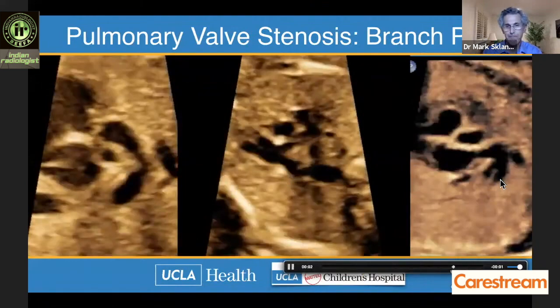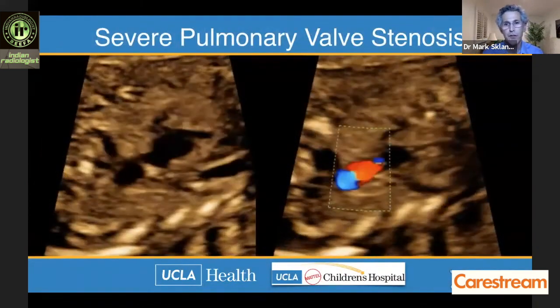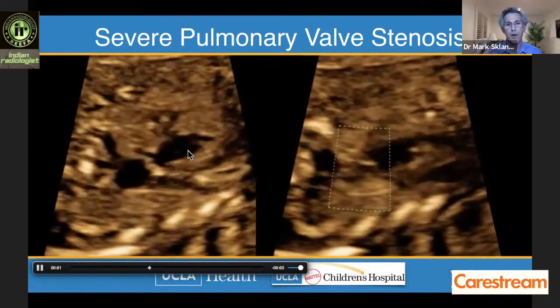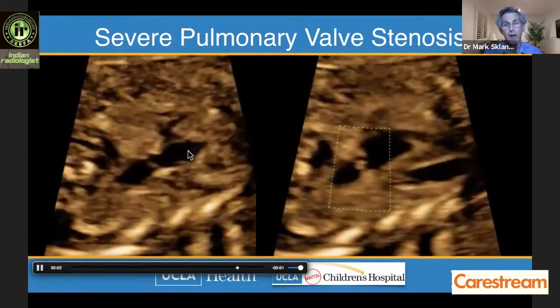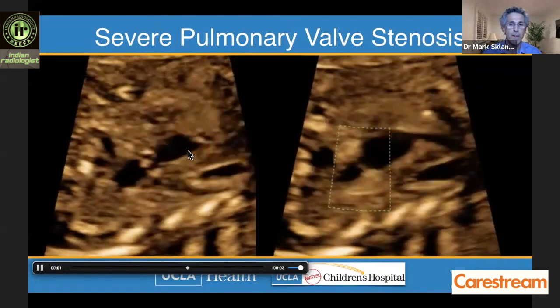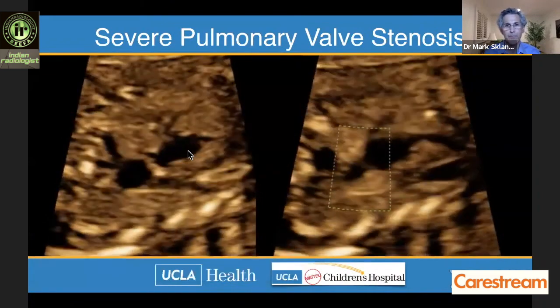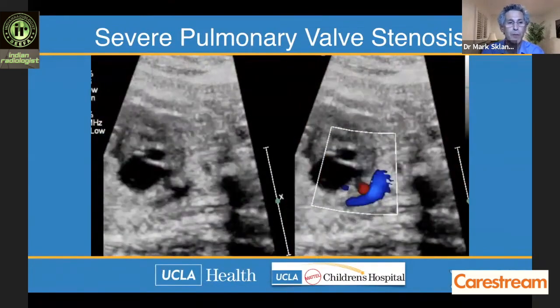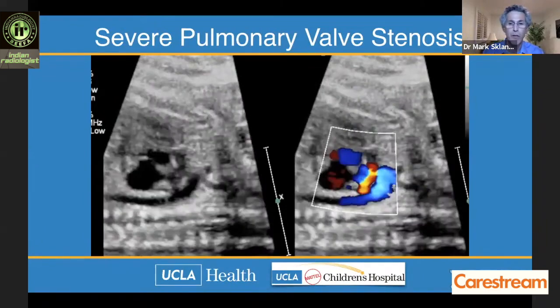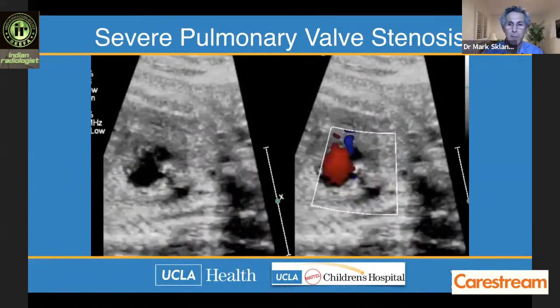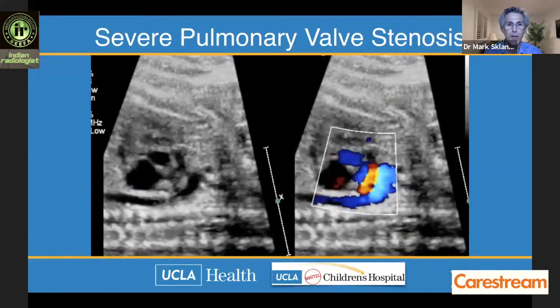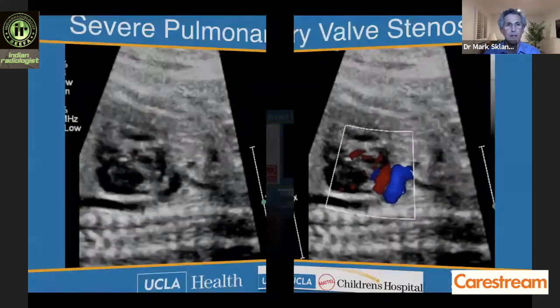With severe pulmonary stenosis, there are significant color flow abnormalities — turbulence, valve that doesn't disappear. The RV may hypertrophy, and in rare cases heart failure can develop, making a very small percentage candidates for in utero pulmonary valve dilation. There will also be retrograde flow — visible on sagittal views entering the ductus retrograde, or on the three vessel view — indicating ductal dependence for pulmonary blood flow. These babies should be delivered at centers where prostaglandin can be started and intervention performed.